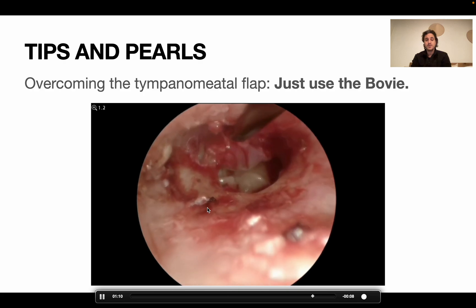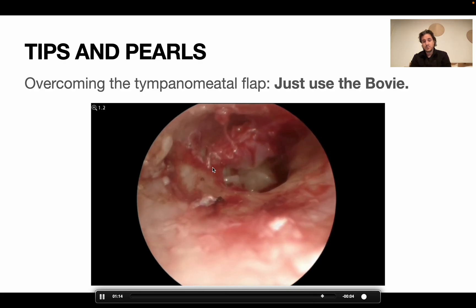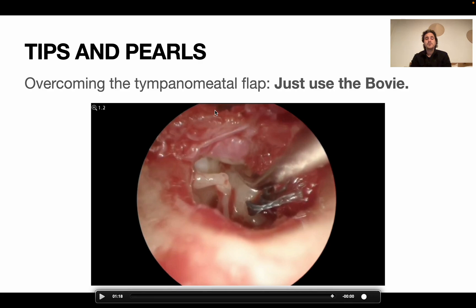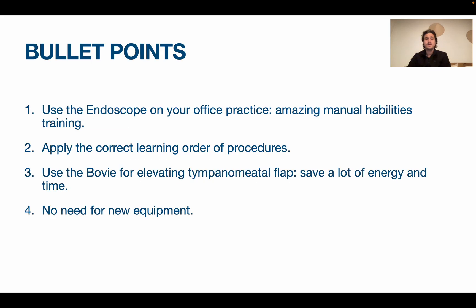This is a stapedotomy case. When I work on chronic ears, I use the first incision at the inferior tip and then one at 12 o'clock, so I normally use a large tympanomeatal flap. There are some papers on this if you want to read further.